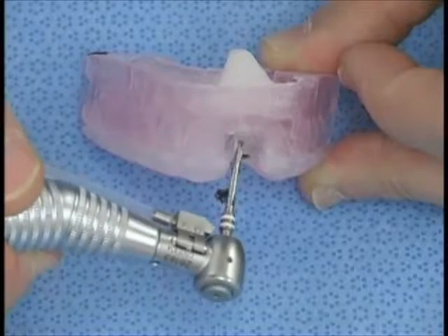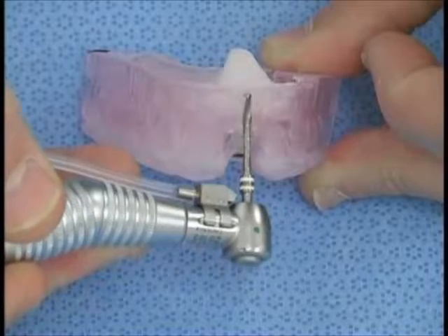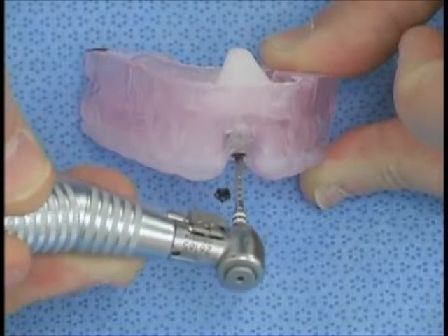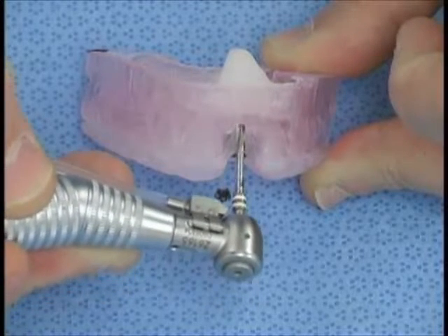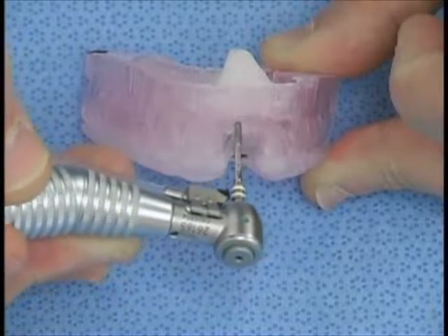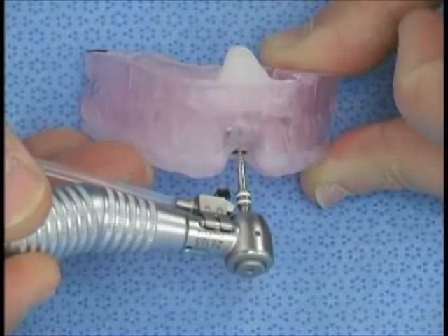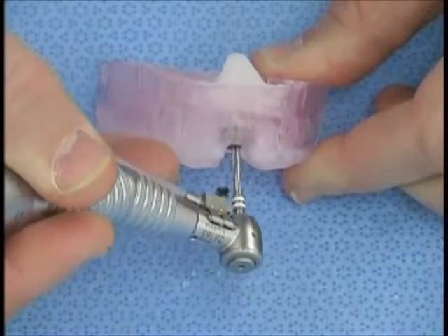Okay, for this exercise, we're going to use an 11 millimeter implant as a teaching tool. And so we go with the 11 millimeters, we add the 5 millimeter distance of the titanium tube or guide tube that you see here. That would make for 16 millimeters. And then you can decide whether you need to go 2 to 4 millimeters below the gingival margin, depending on the relationship of the adjacent dentition. In this case, we're going to try to go about 3 millimeters below the gingival margin, and we'll get a good purchase point.